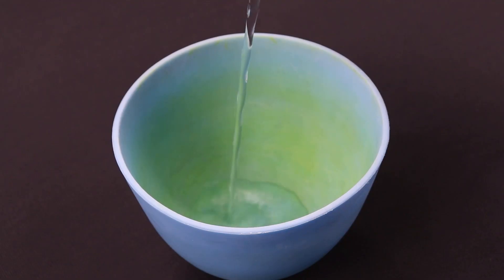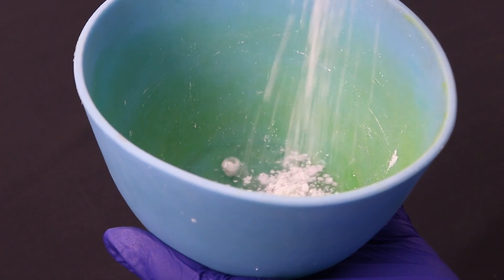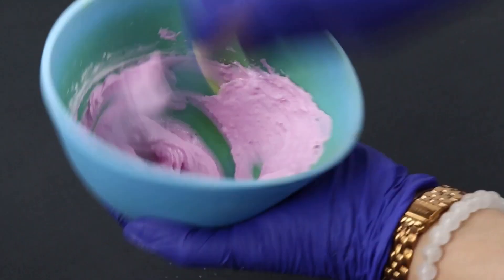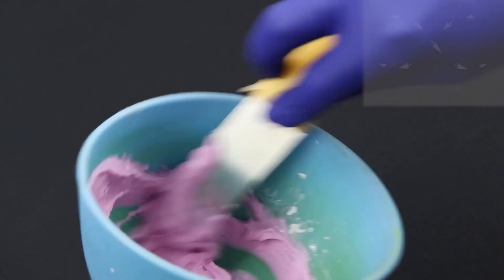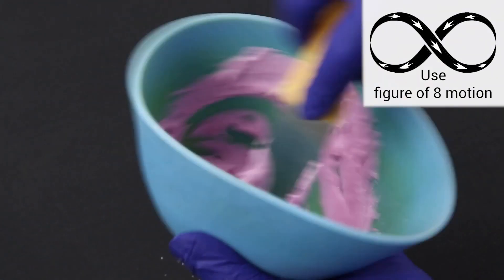Start with measuring the correct amount of water and pour it into the mixing bowl. Slowly add the alginate powder to water while continuously mixing with the spatula. Mix until the mixture is smooth and free of lumps, and be sure to scrape the sides and bottom of the mixing bowl to ensure complete mixing.